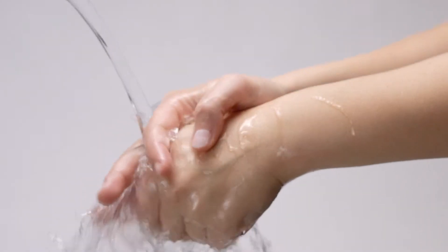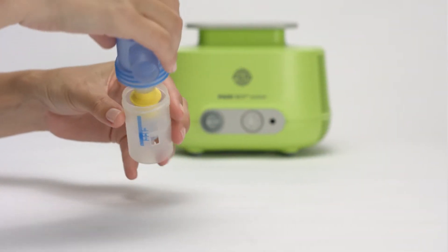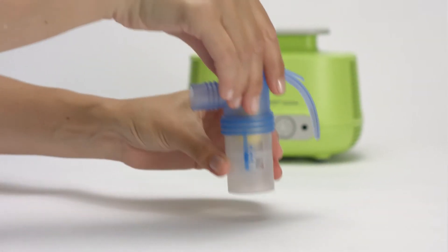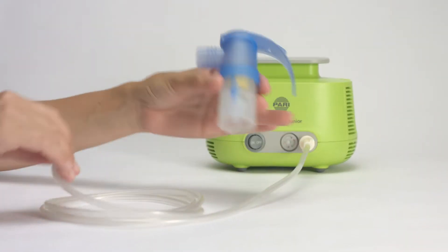Wash your hands thoroughly before each inhalation session. Assemble the parts of the nebulizer with the correct nozzle insert, then connect the nebulizer and compressor with the connection tubing.